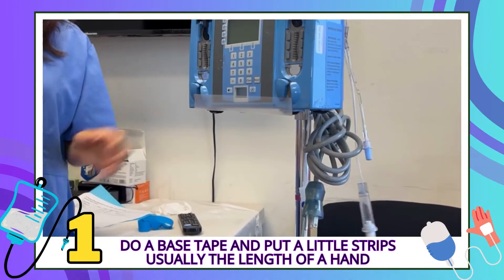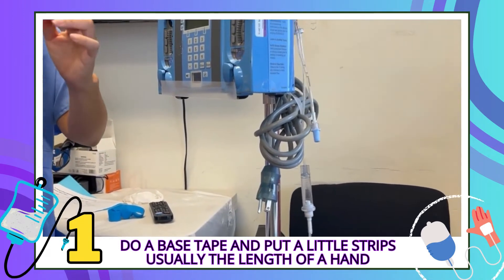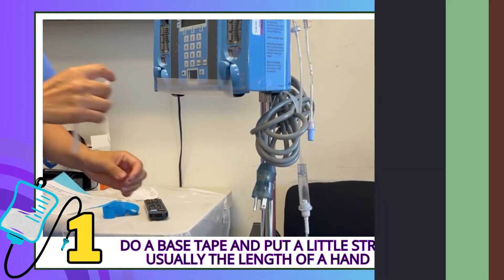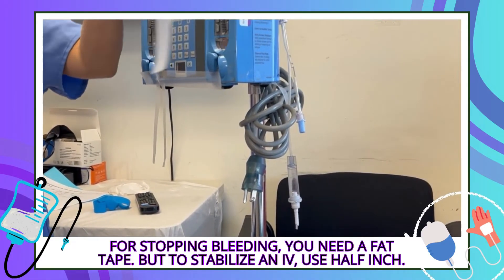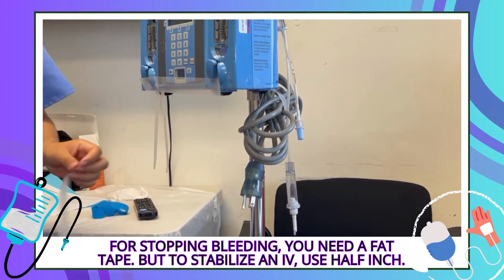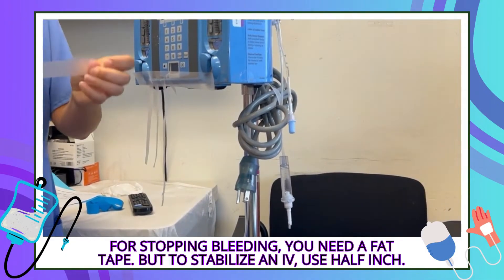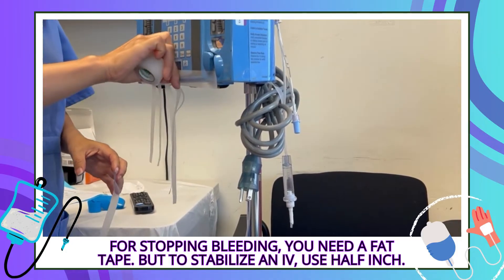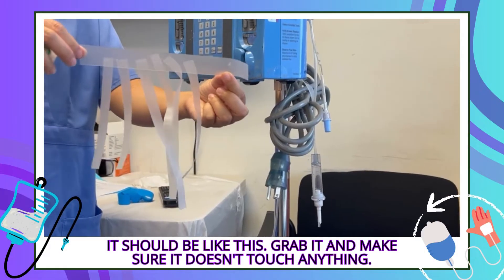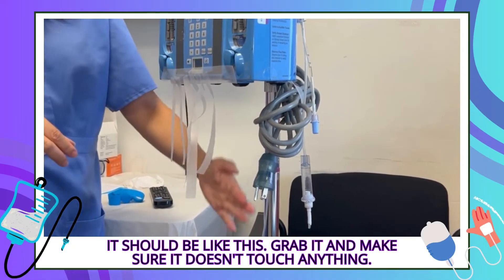A base tape right here, and then you can put everything on — usually the length of the hand. For stopping bleeding you want a fat tape, but to stabilize an IV you want really half-inch tape that can easily tear apart. It should be like this — I know it looks funky, but you just grab it and make sure it doesn't touch anything. Nothing but air.